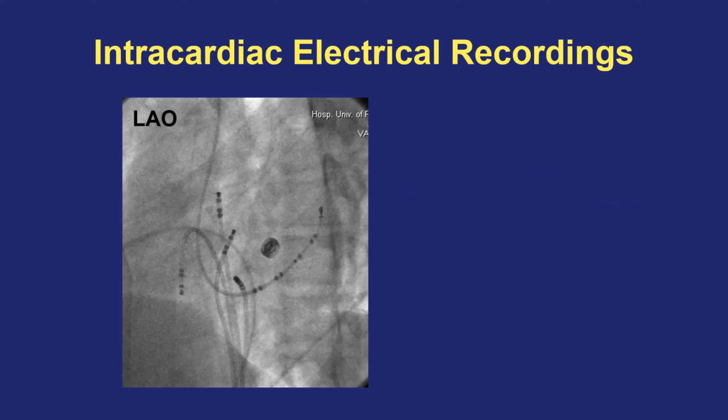If we are to fully appreciate, using intracardiac catheters, the way wavefronts move through cardiac tissue, you need to be recording local potentials at multiple positions at once. This means putting multiple catheters up in the heart, and each catheter that you place usually has multiple pairs of electrodes on it. The catheters are strategically positioned at locations where we want to know the timing of activation. For a moment though, in this image, let's forget that 4 of these 5 catheters are even present and focus just on one of them.